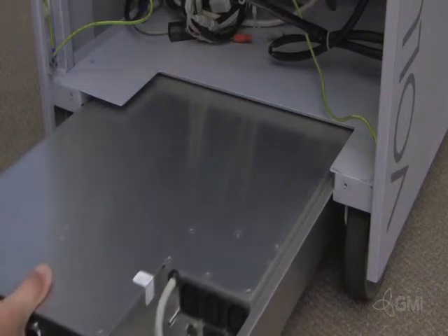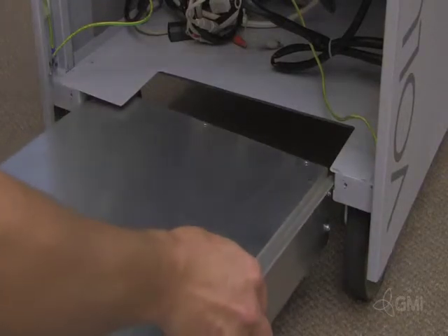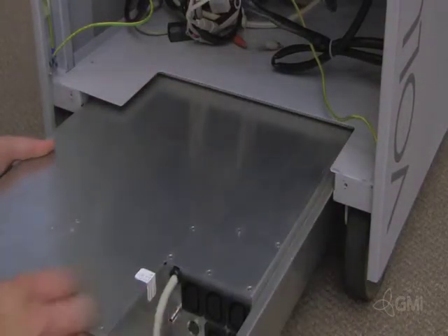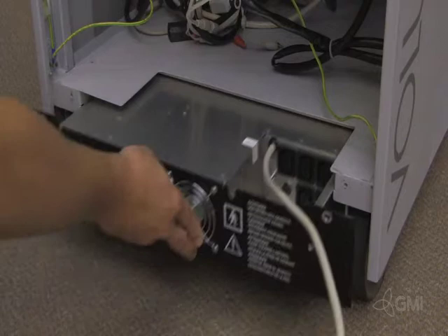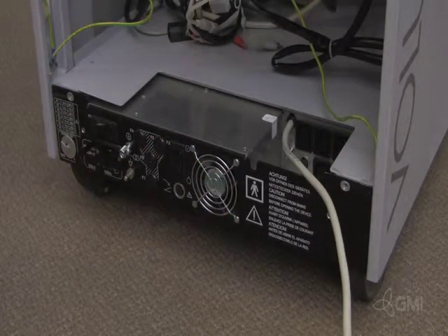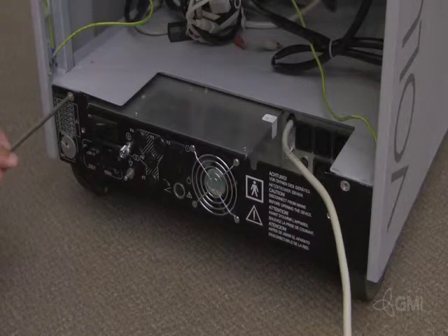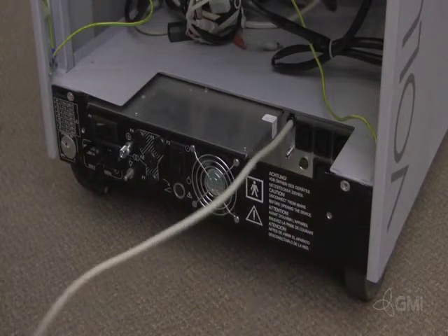Take care not to drop it. Use two people if needed. Install the replacement CPN using the slide rails. Secure the CPN to the chassis.